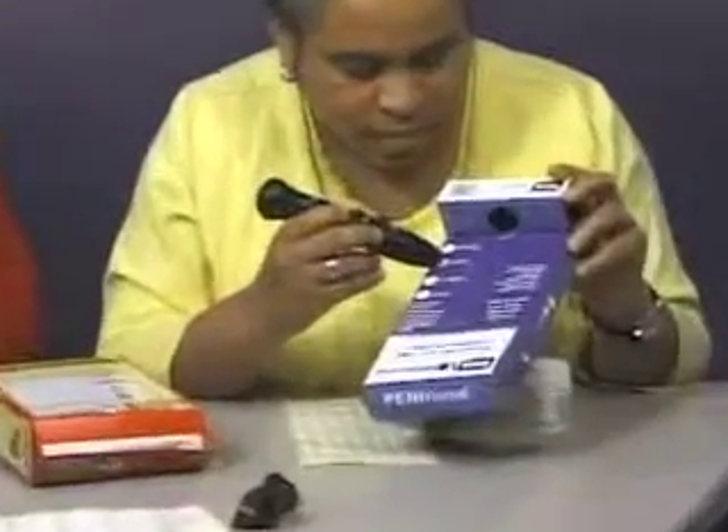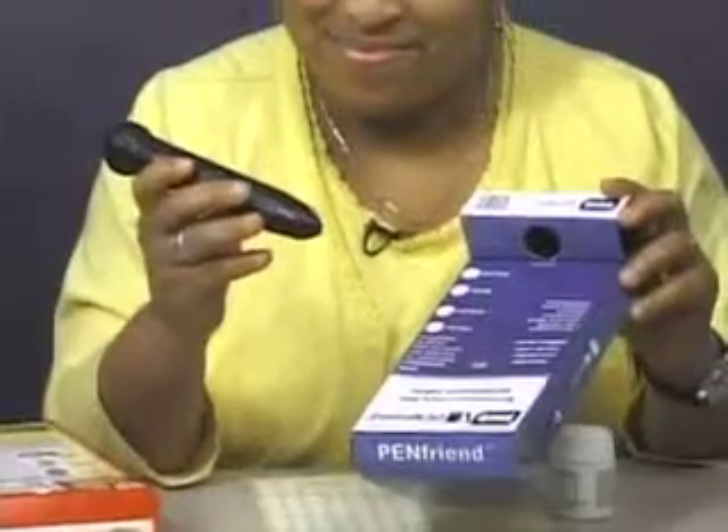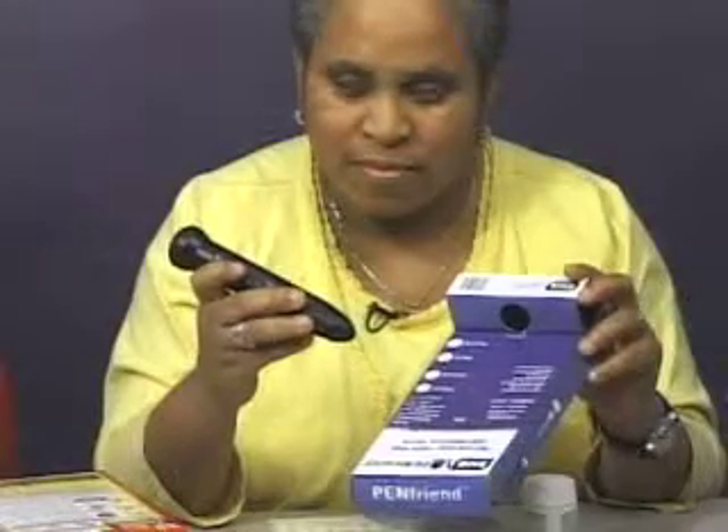Let's try one of these out. [Pen reads:] Mode. The third button down is the mode button. This button switches between the pen's different settings. When you first switch on the pen, it is in the recording setting. If you want to find more information on this device, you should go to the RNIB website. We'll be back soon with more technology.